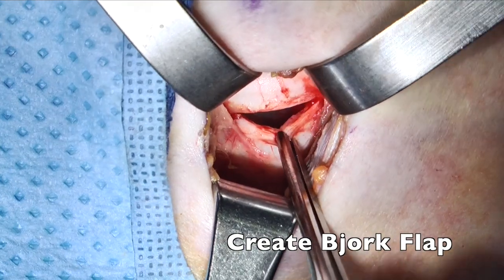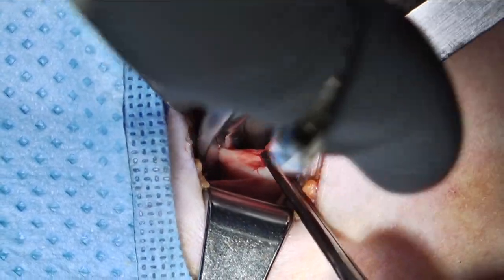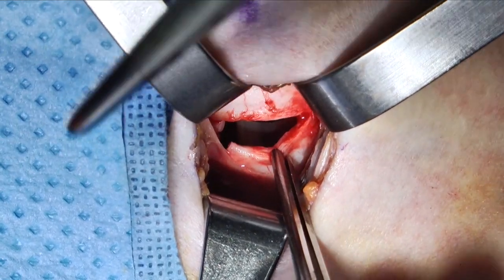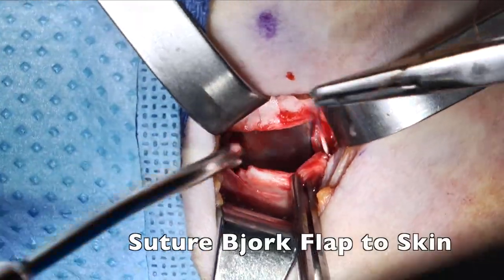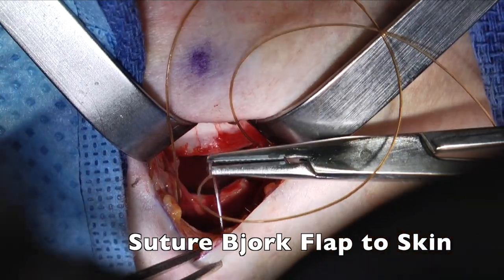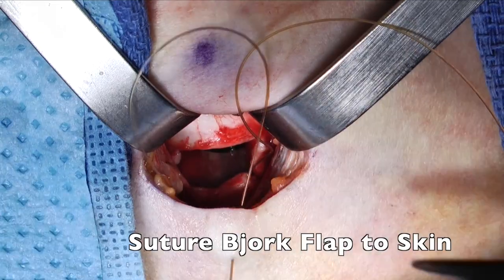At this point, a Bjork flap may be created to help with tracheostomy tube changes. However, this is based on surgeon preference. After creation of the Bjork flap, it is then sutured to the skin using a chromic stitch. It is important to make sure that you are underneath the cartilaginous tracheal ring in an attempt to place a secure stitch.